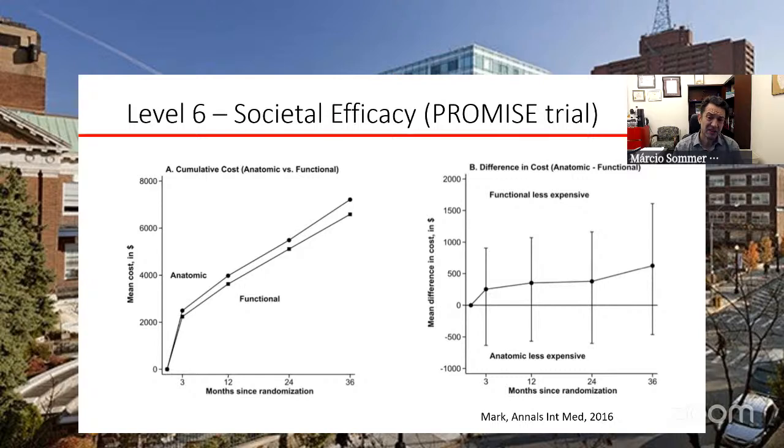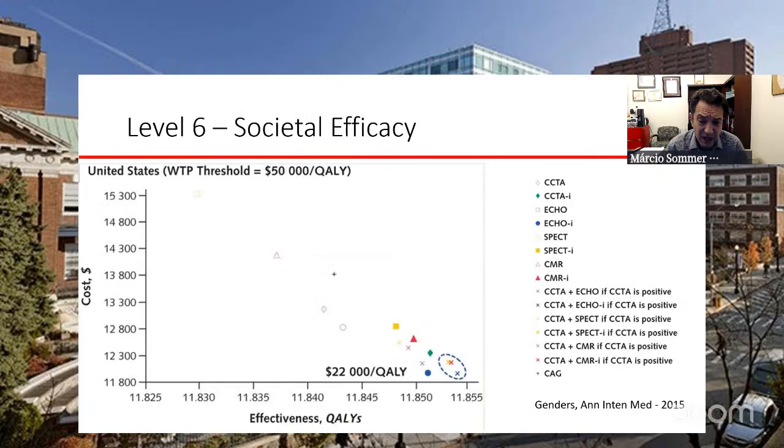I think this kind of data is very sensitive to how you do things, because this is real life. So if you decide to be more aggressive on some findings or more conservative, that impacts a lot. So sometimes modeling with predefined parameters might be more interesting. This is kind of old data, but this is very interesting data, because even in 2015, within the context of some of the tests were not as good back then as they are right now, especially for CT.